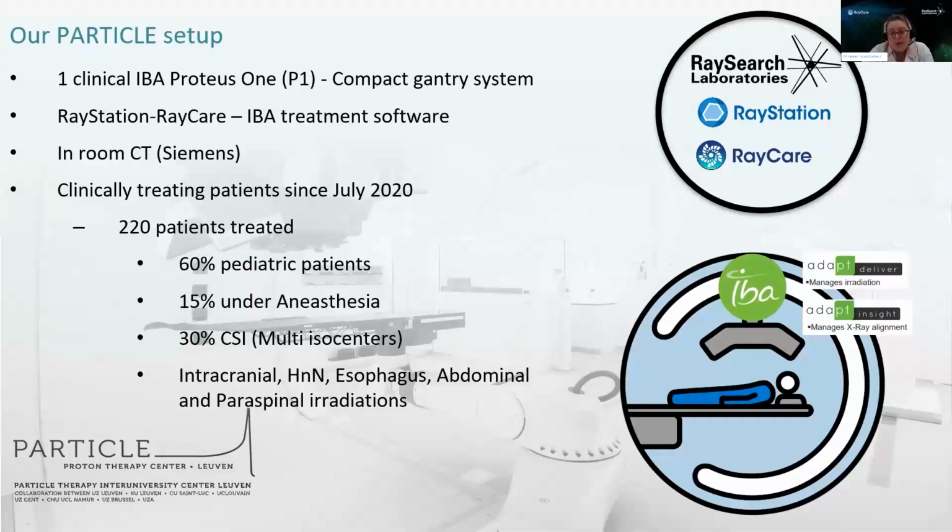We have the full RaySearch software spectrum, meaning RayStation and RayCare, and that's interacting nicely with our IBA software, so IBA imaging and delivery software named Adapt Insight and Adapt Deliver. We also have our Siemens in-room CT, and we've been clinically treating patients for a bit more than 3 years now, so actually 4 years in July this year, so yay. And at the time, we were one of the first with a specific RaySearch IBA setup. And since being clinical, we've, of course, incorporated multiple improvements into our workflow, which I'd like to show you all in this session, basically.